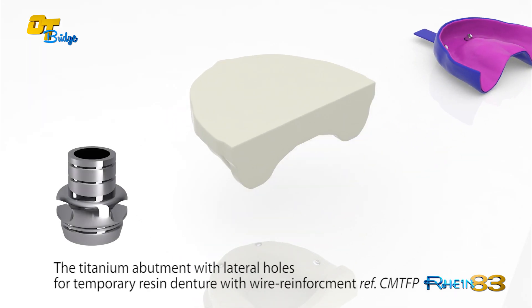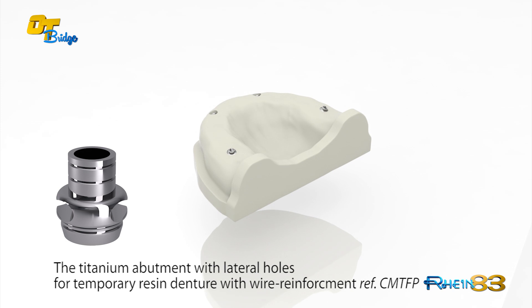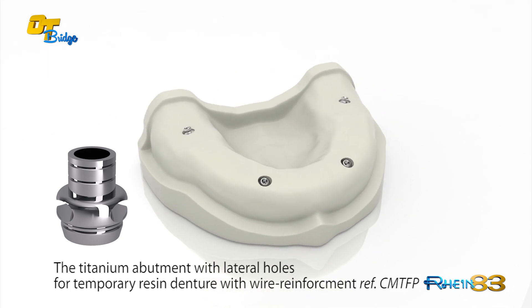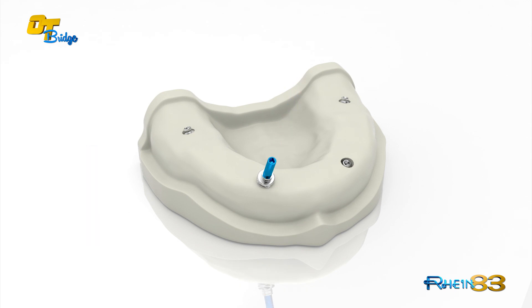The titanium abutments with lateral holes are used to create a temporary reinforcement for the immediate loading technique. The technician places the titanium with lateral hole over the OT Equator abutments to tighten the screws.